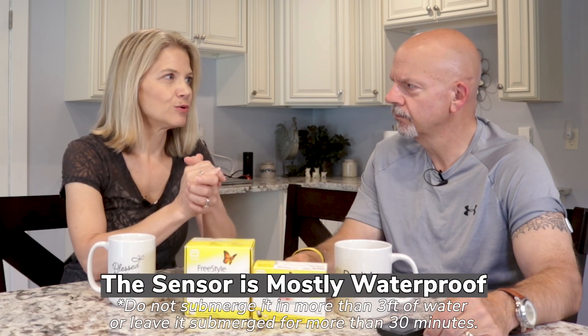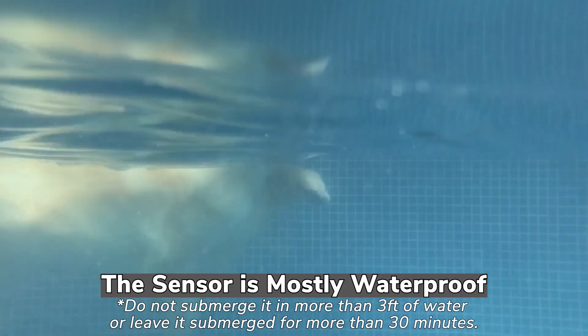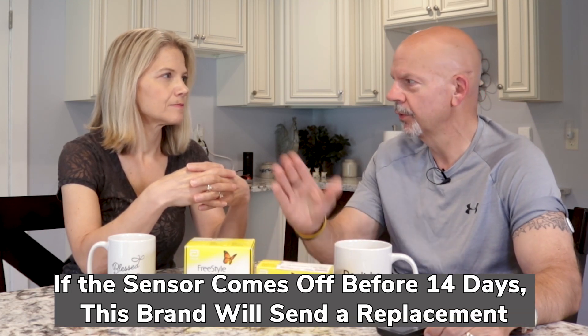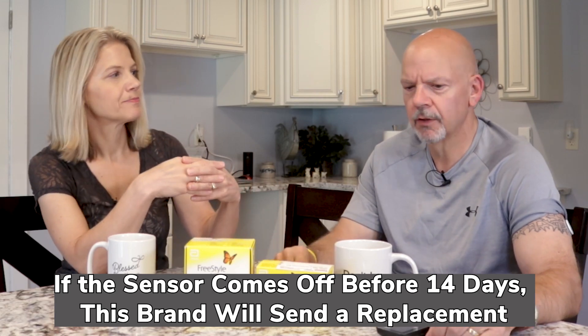It is waterproof to a degree. You can swim in it, actually, but they say you're not supposed to immerse it more than three feet deep, and you shouldn't be underwater for more than 30 minutes. Little things like taking a shower are not prohibitive. And I was told at the pharmacy that if it comes loose before the 14-day period is up, Abbott will send you a replacement one free.